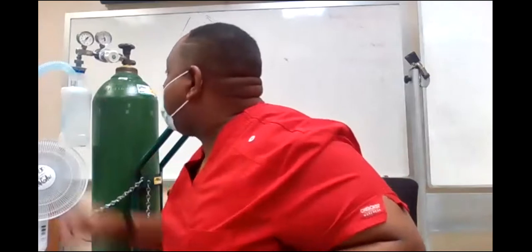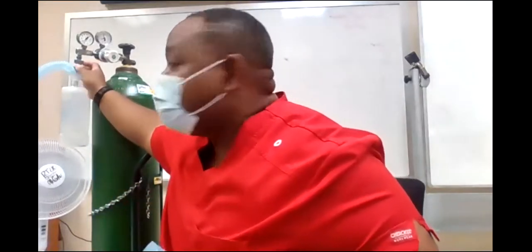Now, the trick is, nurses make the mistake of saying, oh, he's on 35%, he's on 40%, but he's on the air tank. I don't care what this says, he's only getting what? Medical air. So a lot of times they make that mistake, all right? Or they'll chart in the notes, he's on 40% trach collar, but he's not. He's on 21% because he's on the yellow tank, all right?